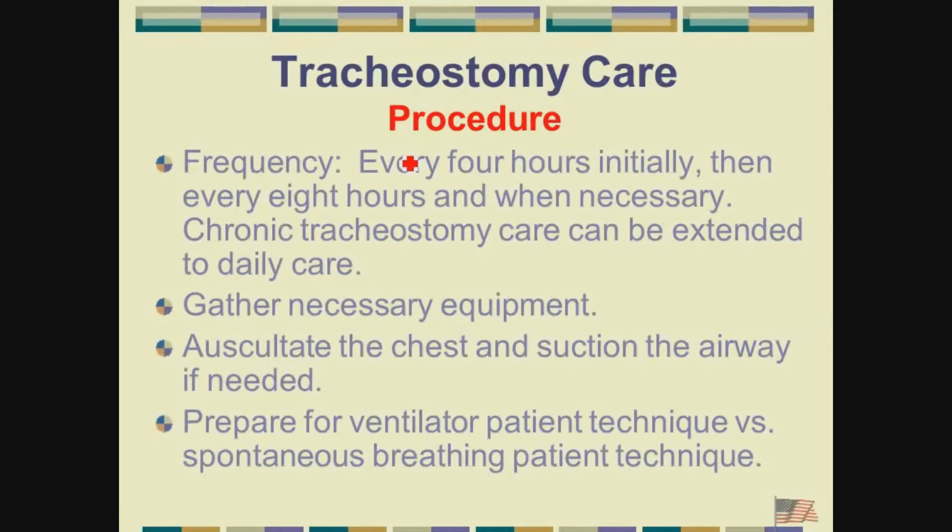Two different scenarios that we're going to have. If a patient's on a ventilator, it's a little bit different of a process than if they're spontaneously breathing. For your PE, they'll all be on a trach collar, so we're not concerning ourselves with the ventilated patients. There's a little bit more of a need for a quick swap when a patient is being mechanically ventilated. A lot of the patients you'll encounter who have a trach will not be on a ventilator.